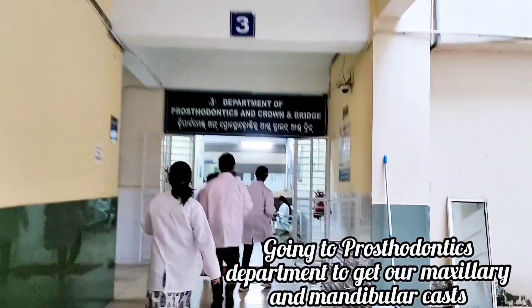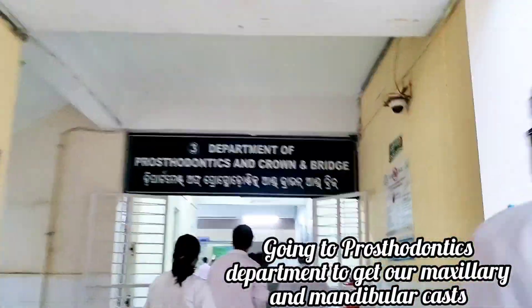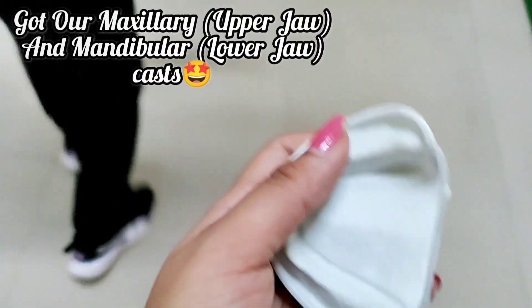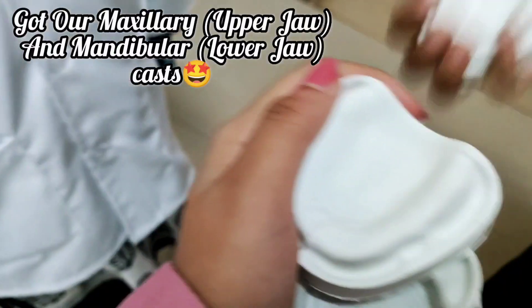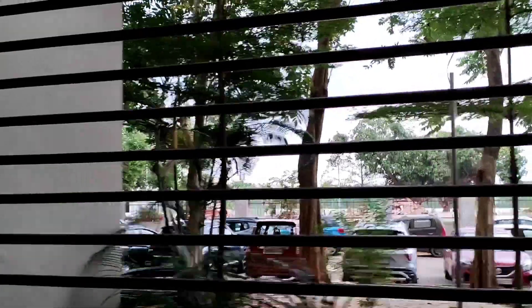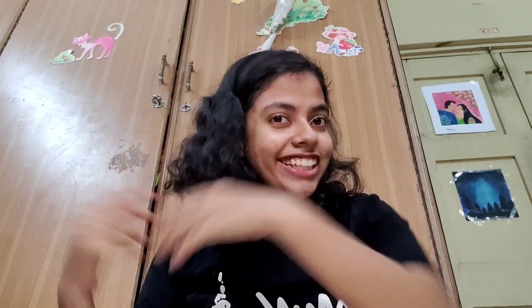Going to the Prosthodontics department to get our maxillary and mandibular casts. So recently we got our Prosthodontics kit and today I'm going to unpack the entire kit and let's see what all things we get inside. Come, let's find out.